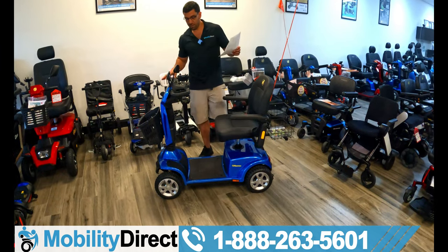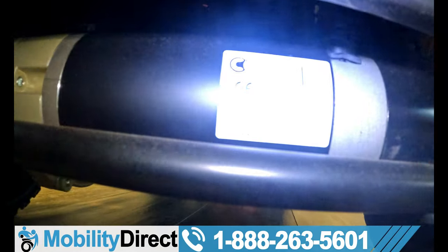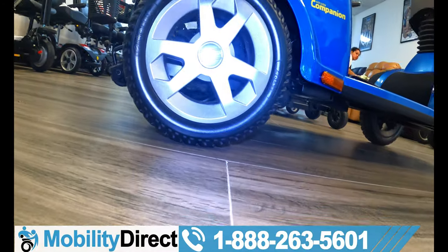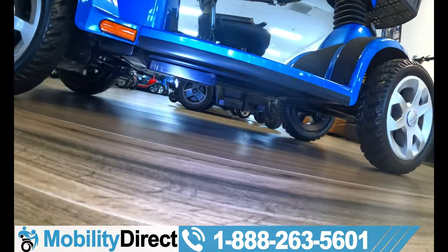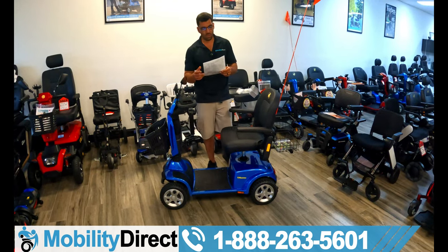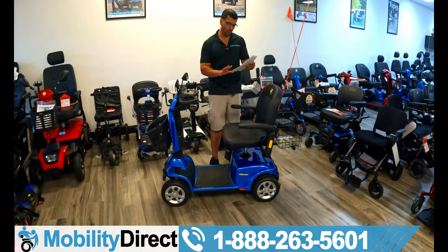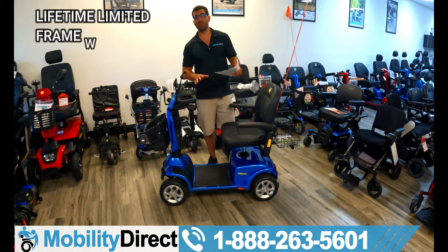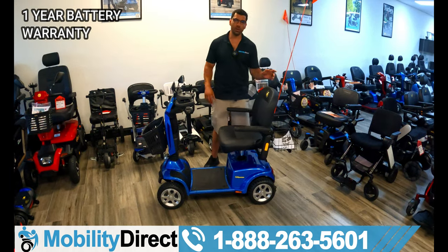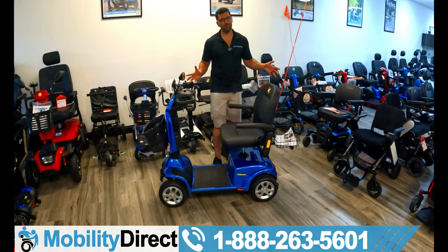This unit has full suspension, giving you a really smooth ride — it has four independent suspension coils. The tires are flat-free, non-marking tires that won't mess up your floors, measuring 10.75 inches front and rear. It also has two-inch anti-tip wheels in the back. It has a great warranty: lifetime limited warranty on the frame, two years on the drivetrain and electronics, and a one-year limited warranty on the battery — which is the best among manufacturers, as most only offer three to six months.